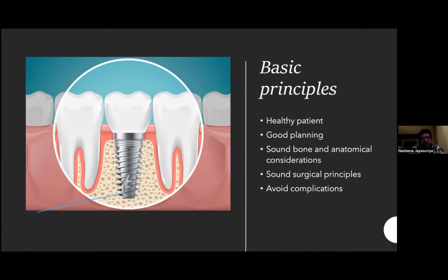Complications can happen. You can't avoid that. But certain complications can be avoided if you think better. For example, one dentist told me he forgot. Now, you know that when we drill, the drill will be turning very fast. But when you want to put the implant in with the handpiece, then it rotates very slowly. Okay, you might understand this.